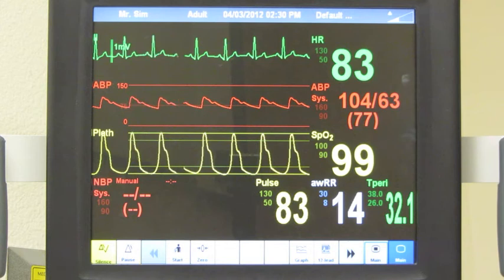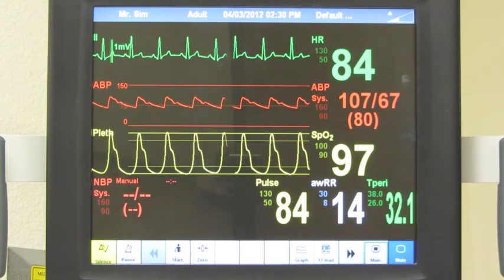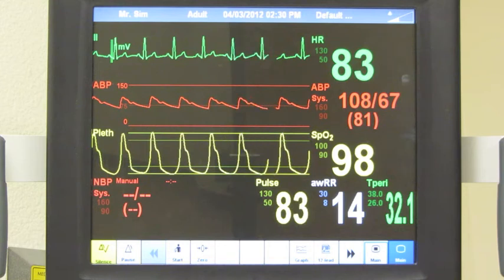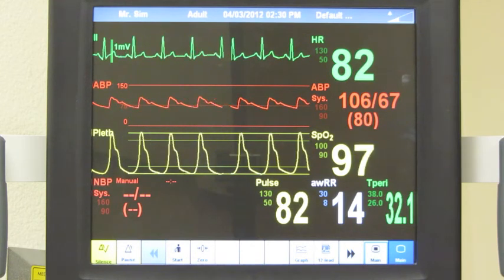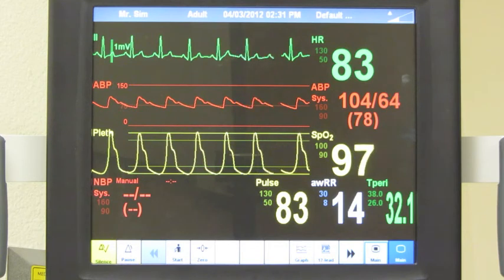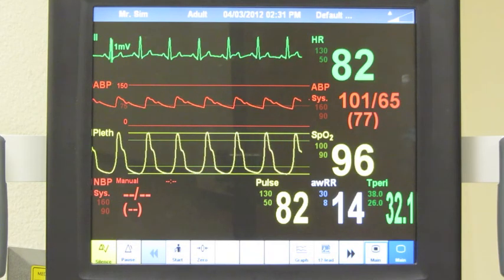You'll note in the particular scenario you were presented that there were minor fluctuations around the initial set point of 98%, so that you might have seen anything from 96, 97 to 98 or 99. At one point in time, however, the SO2 saturation level was purposefully dropped to 96%, a 2% drop.